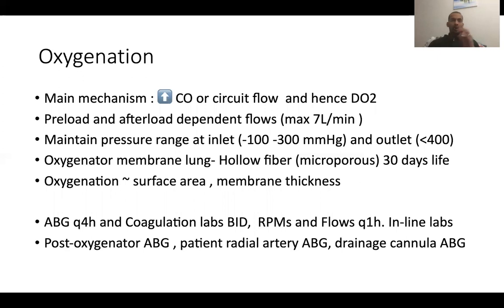So unlike the ventilator where you crank up the FiO2, here we have to crank up the output, the amount of blood that's flowing through the oxygenator. That is going to affect the oxygen levels in the blood. Okay, so that's number one.